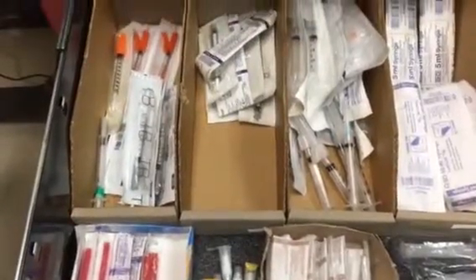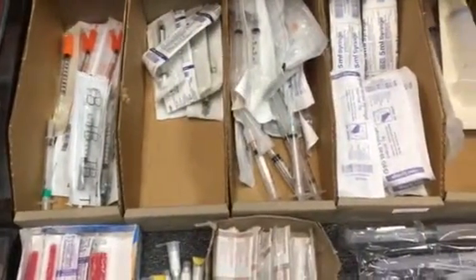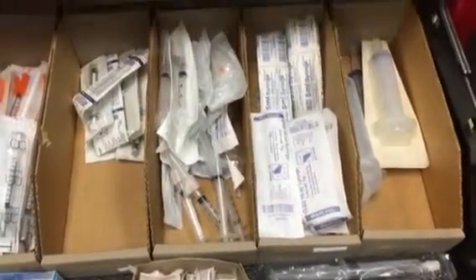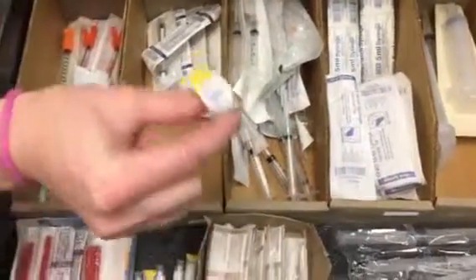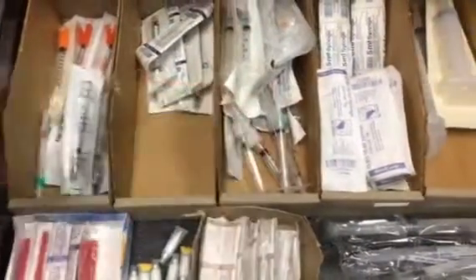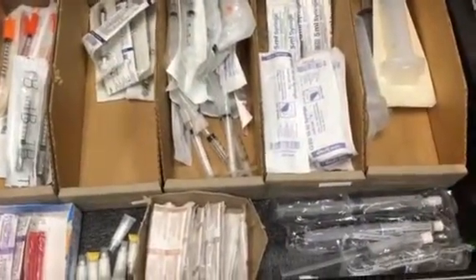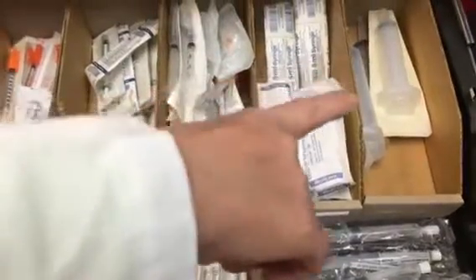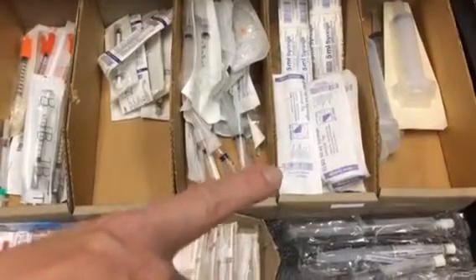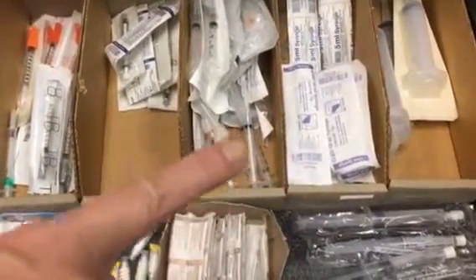So this is your needles and syringes drawer. Anything that you should need for sharps or a syringe, you will find in here. Here is for your insulin pens, and then flushes for an IV should you need. At the very end over there are larger size syringes. Sometimes you may use them for your NG tube and for the irrigations.